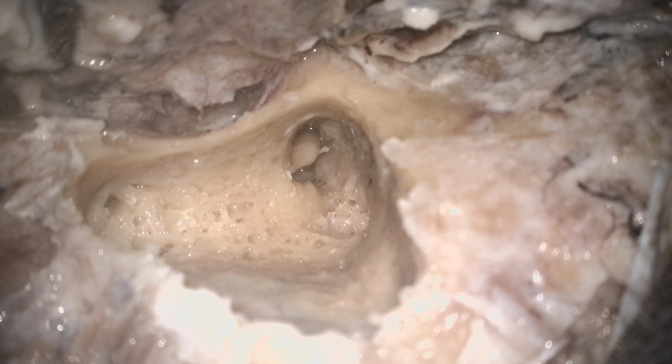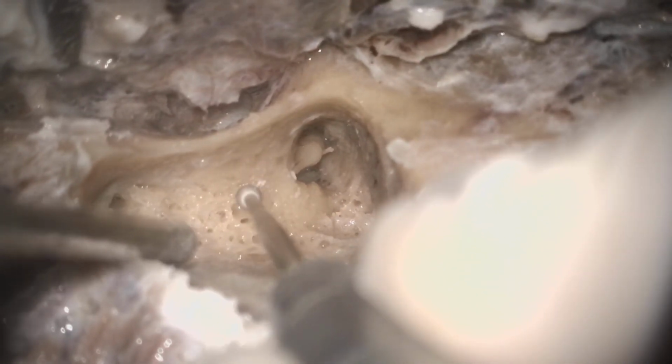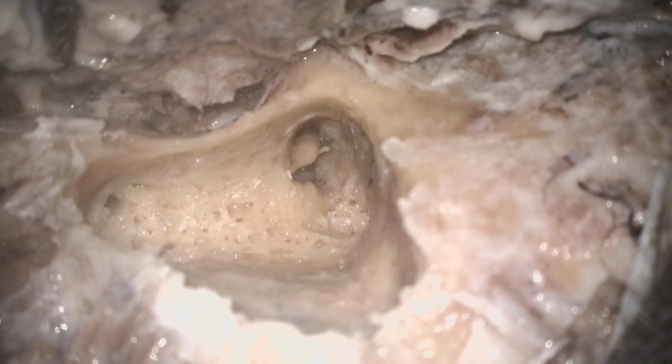That is actually the benefit of doing posterior tympanotomy from this side. Okay, so now we will drill the ridge area. Diamond burr number 3-4, this is slightly smaller.